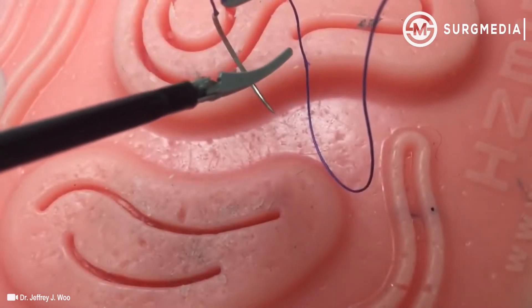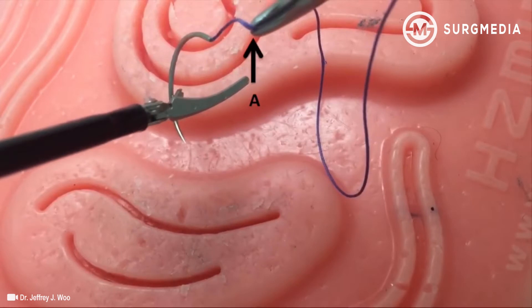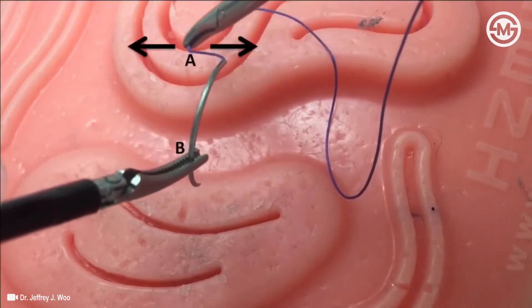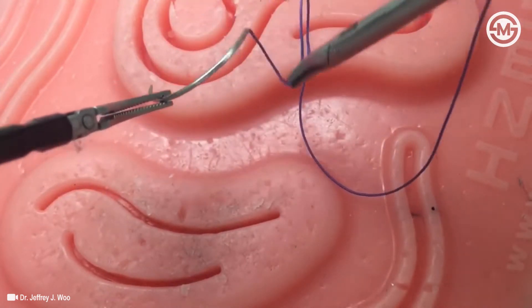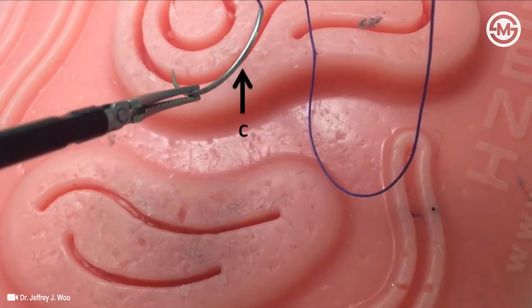Once the needle is within the box trainer, maintain the right grasper at point A, and loosely grasp the needle with your left instrument at point B. While stabilizing your left instrument, with your right instrument gently move in a to-and-fro manner to swivel the needle. With practice, you will be able to move the needle in every direction freely. Swivel the needle such that the light evenly reflects off point C.